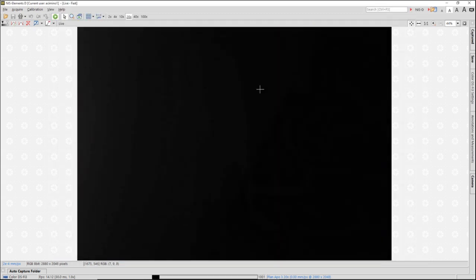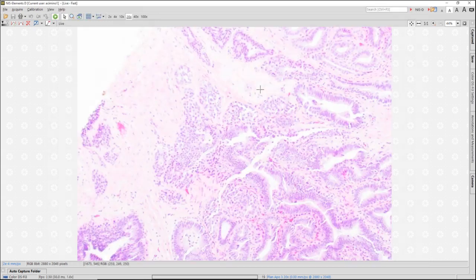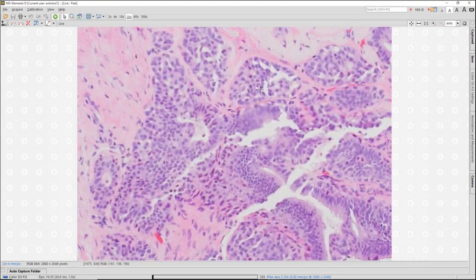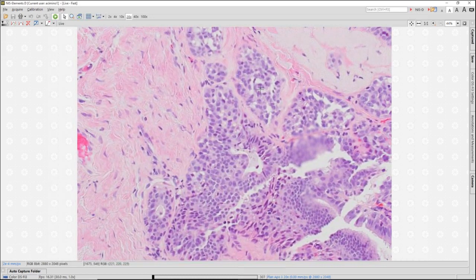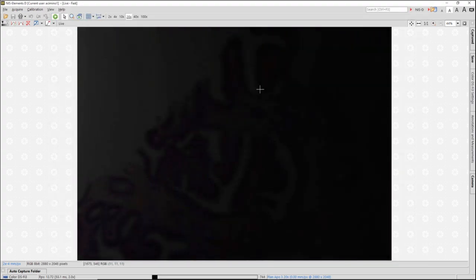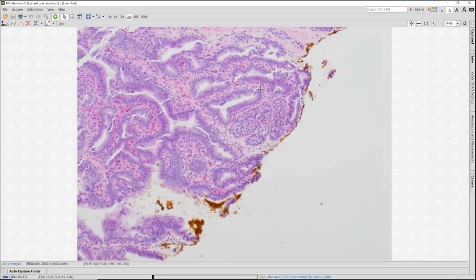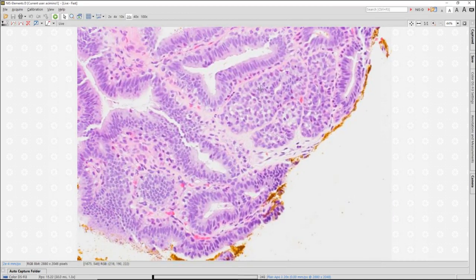And we can see it in a few different areas. Again, the management of atypical lobular hyperplasia has also been evolving in the past 5 years. And the recommendation is, again, to do radiographic pathologic correlation. And if the ALH is not accounting for the radiographic finding, it's considered incidental, as it would be here.